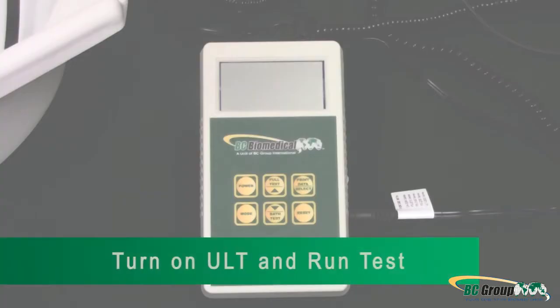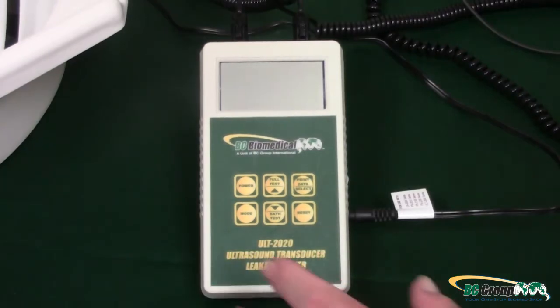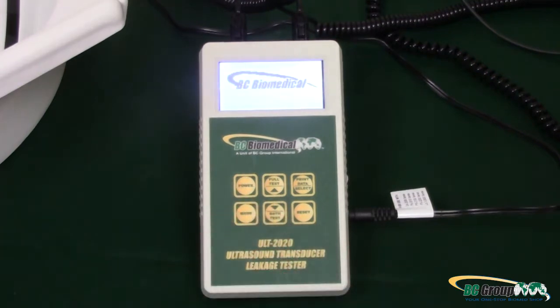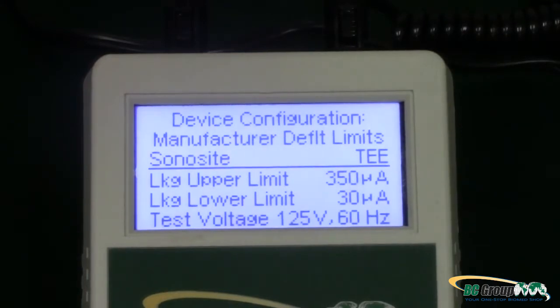Step 4: Turn on the ULT 2020 and run the test. Press the button marked Power on the ULT 2020 — the screen should light up. If not, check to ensure the tester either has batteries or is powered by an AC adapter. Next, verify that the Ultrasound Leakage Tester is set to test the correct Ultrasound Probe on the Device Configuration screen. The Device Configuration screen appears briefly as the tester is powered on and can also be viewed by pressing the Mode button three times.